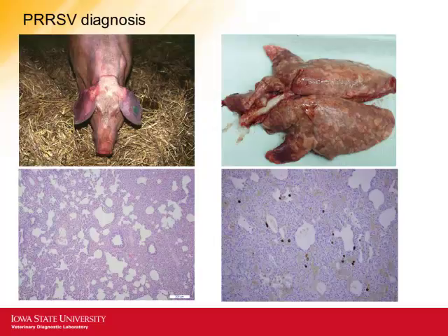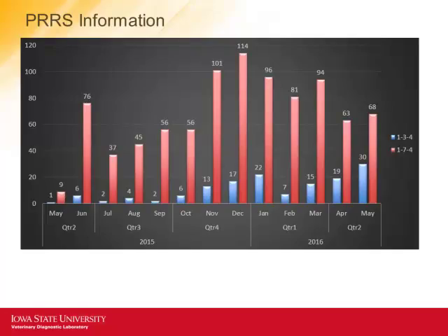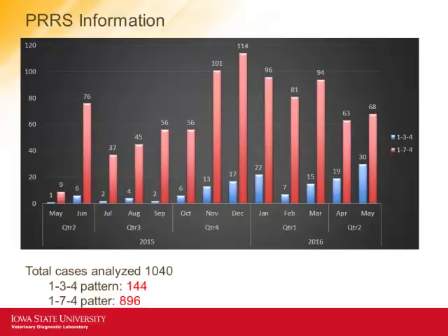Later on, we can do histology. This is a typical pneumonic pattern associated with PRRS, and here is where we start putting it all together. In this picture, we have a staining of the virus. These brown dots are our cells, pulmonary pneumocytes that are infected with PRRS. So these are the very basic steps that we take to make the diagnosis. But in this new world, probably this is not enough. Clinicians need more information, not only to be told, yes, you had a pneumonia caused by PRRS. They need more. And that is when we start doing more analysis.